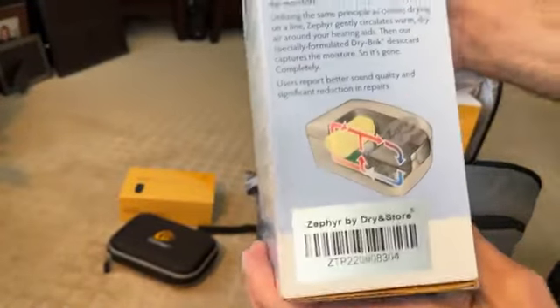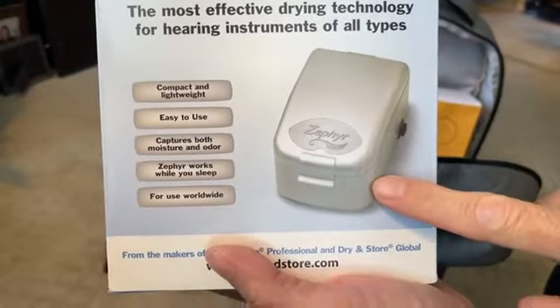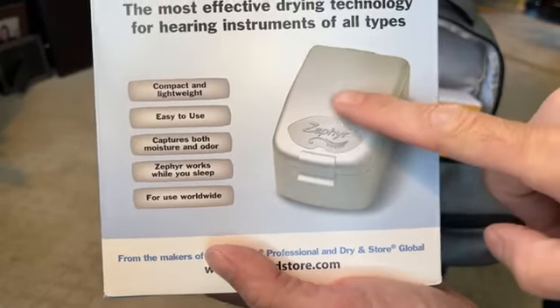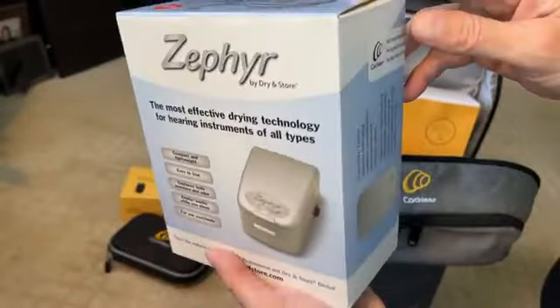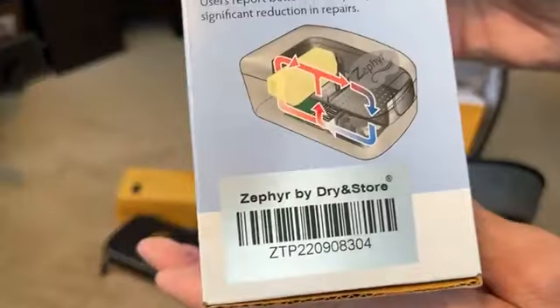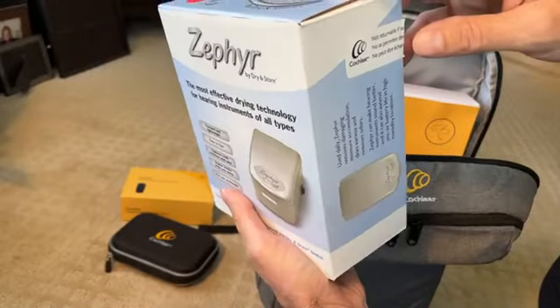Give you a quick view of that — not very exciting to look at the box. At the end of the day when you're about to go to bed, you put all of your device in here, hit the button, and it will dry it out and turn off automatically.